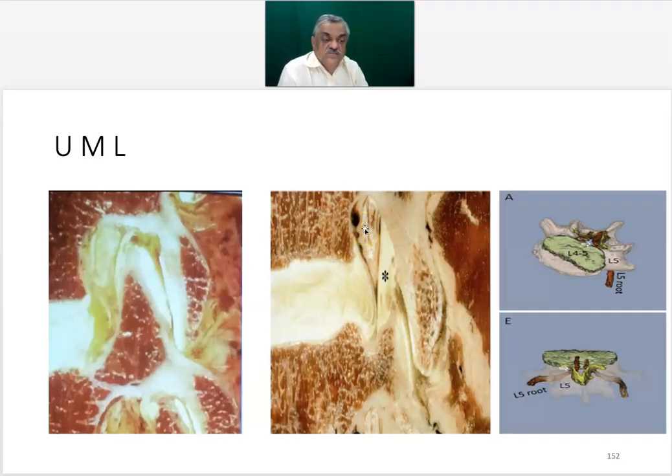And what are the pathologies here? The important part is the nerve situated in the foramen, which could be affected like this by an overriding superior articular process pushing it, or hypertrophy of the ligamentum flavum, shown here. In this picture you can see a 3D fusion image which shows the hypertrophied ligamentum flavum pressing on the nerve in the middle and the upper zone, as can be seen here.